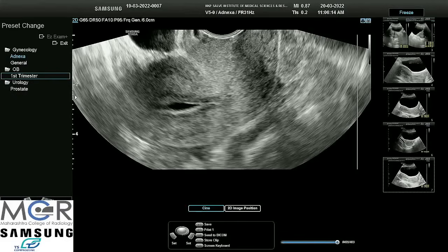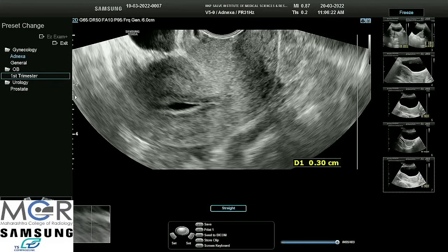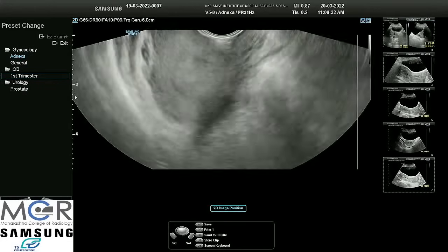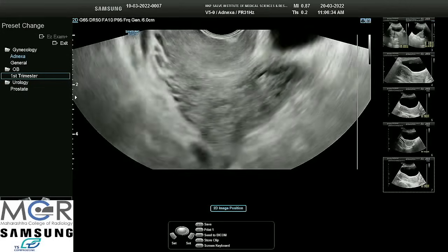The posterior endometrium should be taken near the fundus. The posterior measurement is 2.7 mm. So it was 2.3 and 2.7 — that is almost 5 mm total, which is definitely thin for her age and the day of cycle.